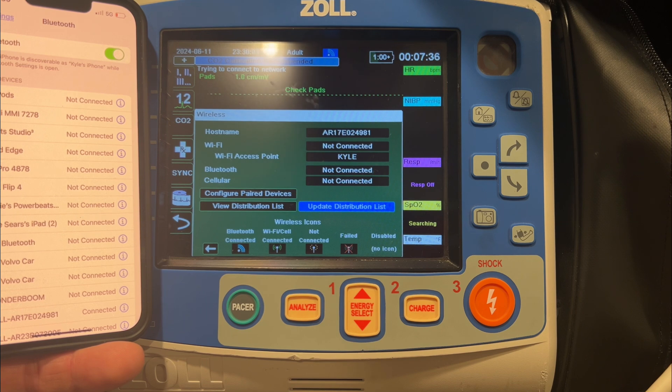For that short period of time, the green light will come on. Transmission complete — we're good to go. Then it goes back to the antenna with the yellow dots around it.